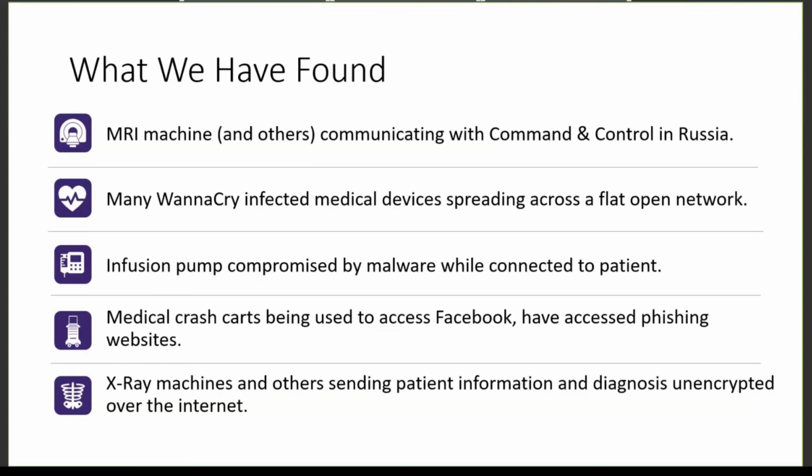We've seen an infusion pump compromised by malware while it was connected to a patient. In this case, the malware was not intended to affect the level of service being provided, but like much other malware and ransomware, it could very much have affected this device while connected to the patient and simply cut off service. We see medical crash carts being used to access Facebook and other sites, and then since have been used to access phishing sites and have been compromised through some of those phishing sites, or have compromised information as a result. And last but not least, X-ray machines and others sending patient information and diagnosis details unencrypted over the internet.